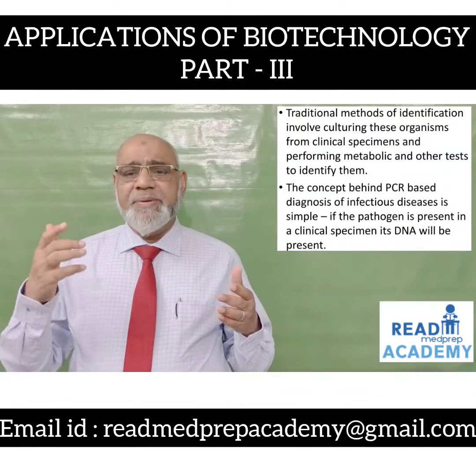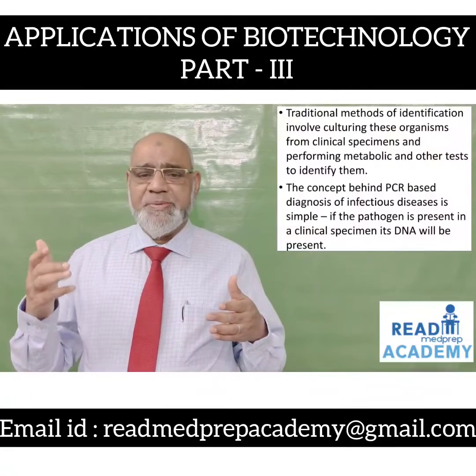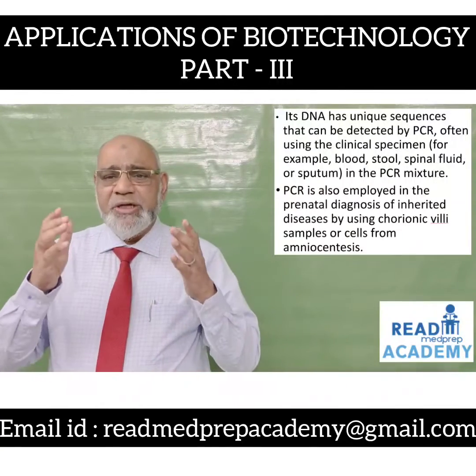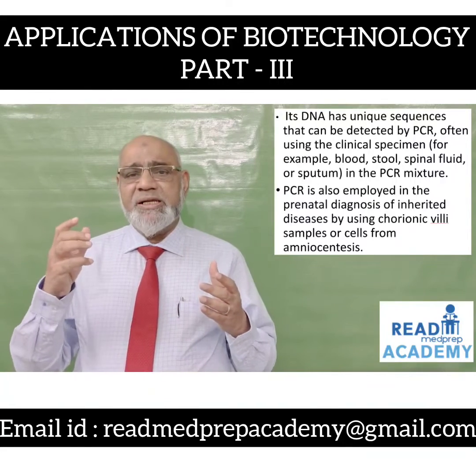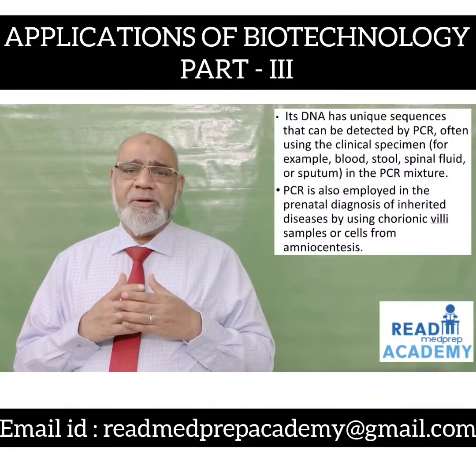The concept behind PCR-based diagnosis of infectious diseases is simple. If the pathogen is present in a clinical specimen, its DNA will also be present. Its DNA has unique sequences that can be detected by PCR, often using the clinical specimen, for example, blood, stool, spinal fluid, or sputum in the PCR mixture.